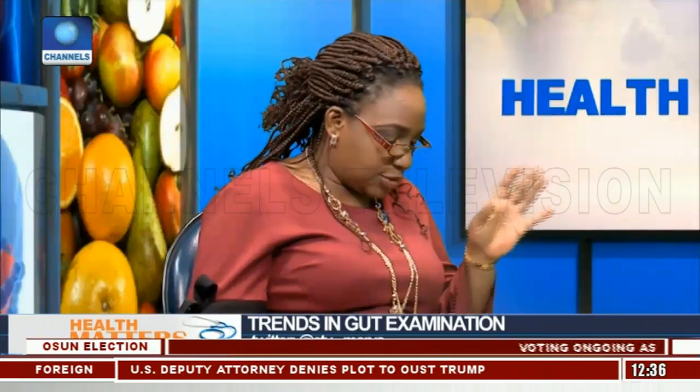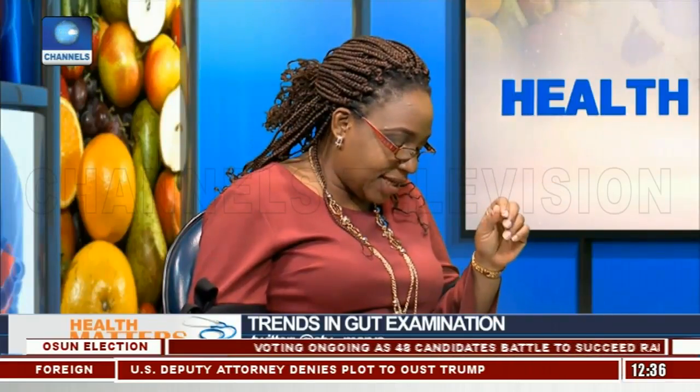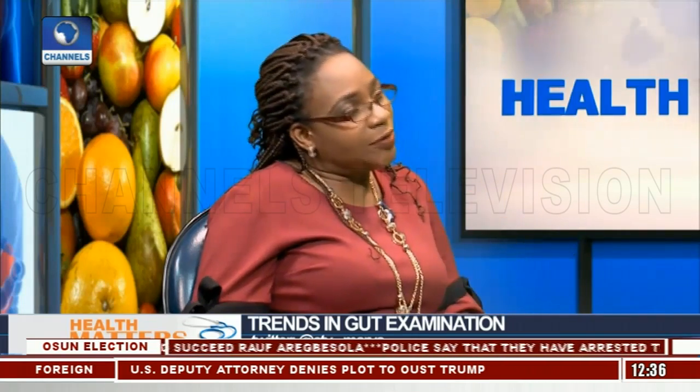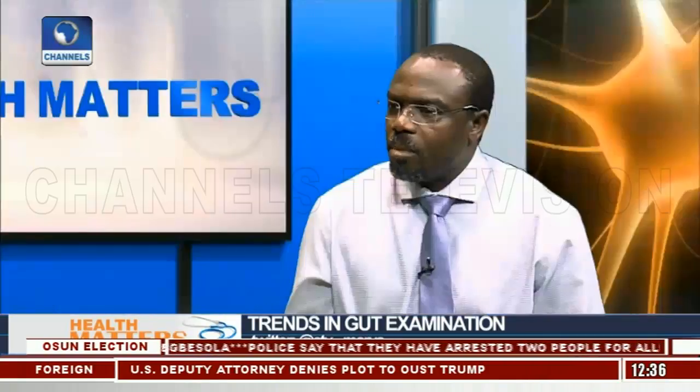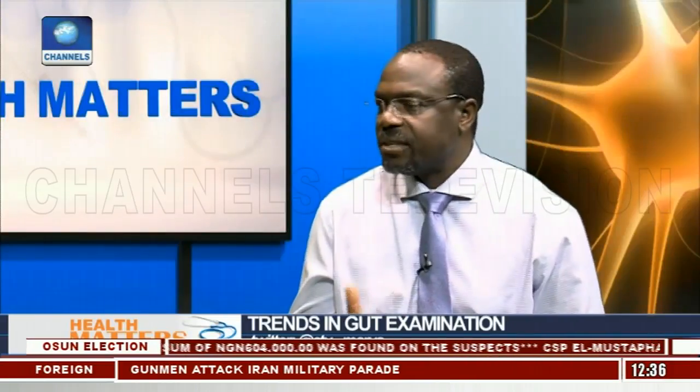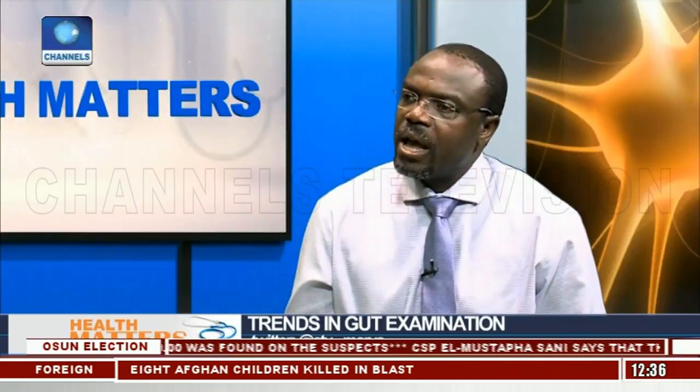Okay, so just quickly describe for us, since we had the 1806 model with the tube, the mirror and the candle, the stages that this has gone through. Well, when I was training, we had rigid endoscopes, and that could only go so far within the gut that is very floppy and has its own natural curves.